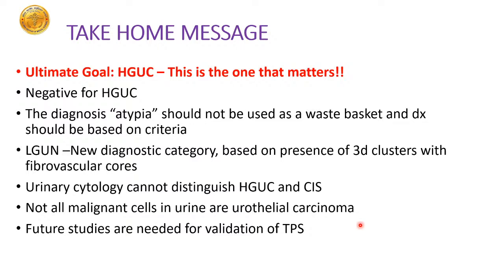So what is the take-home message from all this? Please don't get disheartened by the AUC category or on missing cases. It is a learning ladder for us. The ultimate goal of the Paris classification is high-grade urothelial carcinoma, period. This is the only one that matters because it behaves very aggressively and it needs to be treated aggressively.